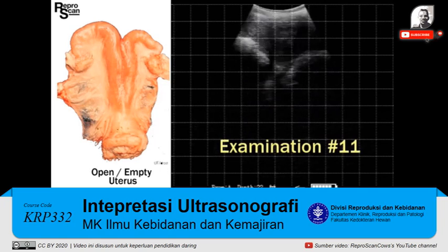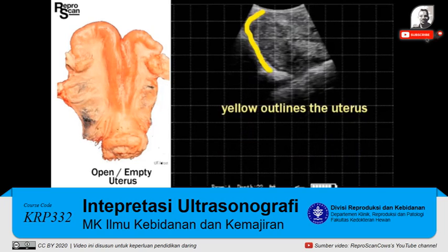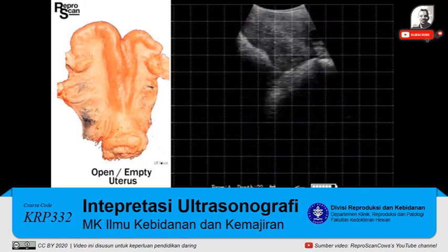On to the last examination, number 11. We see the bladder and that different gray color outlined there. We're going to rotate to get some cross-sections.